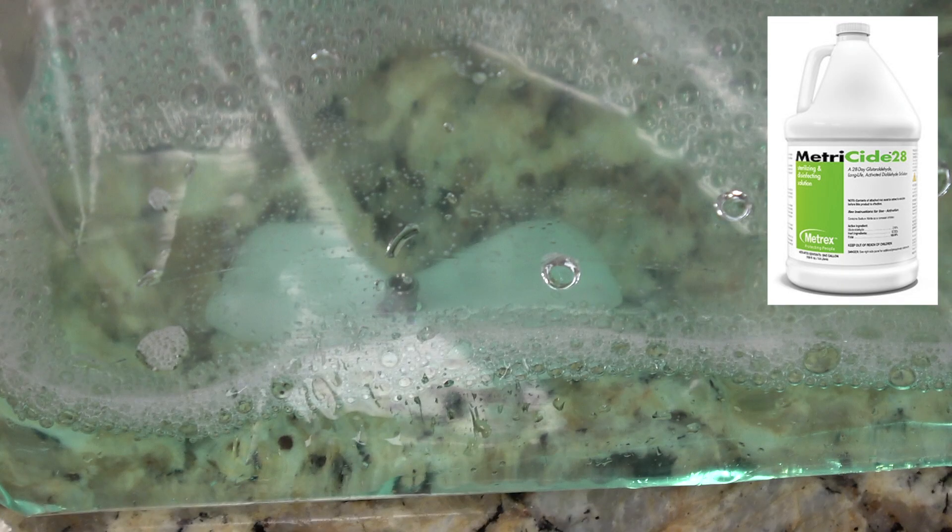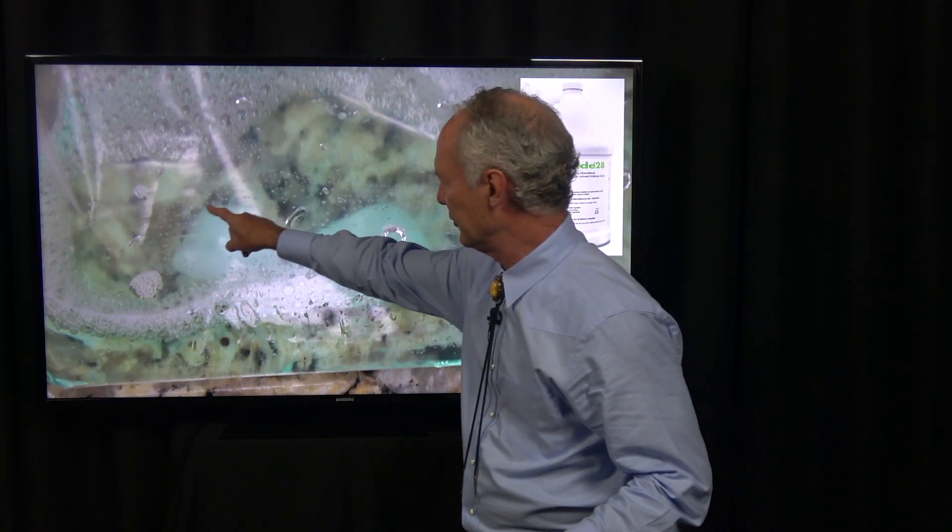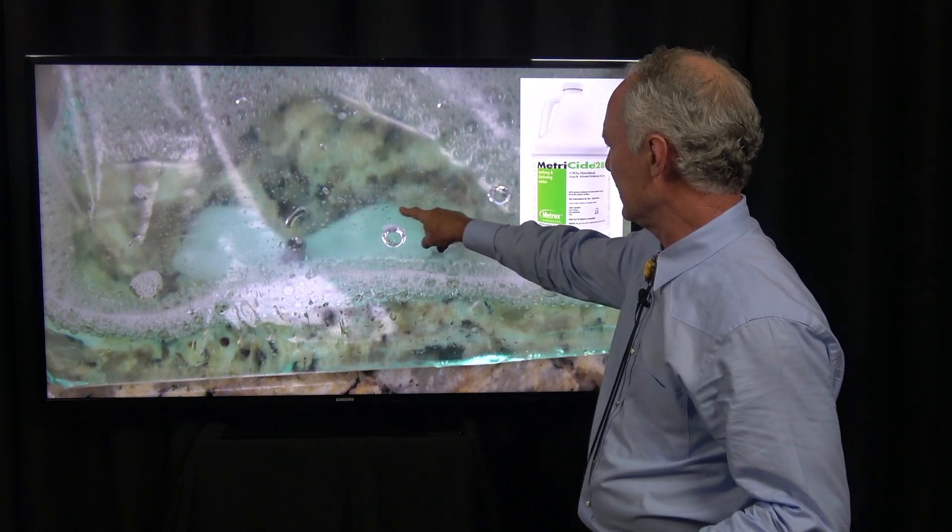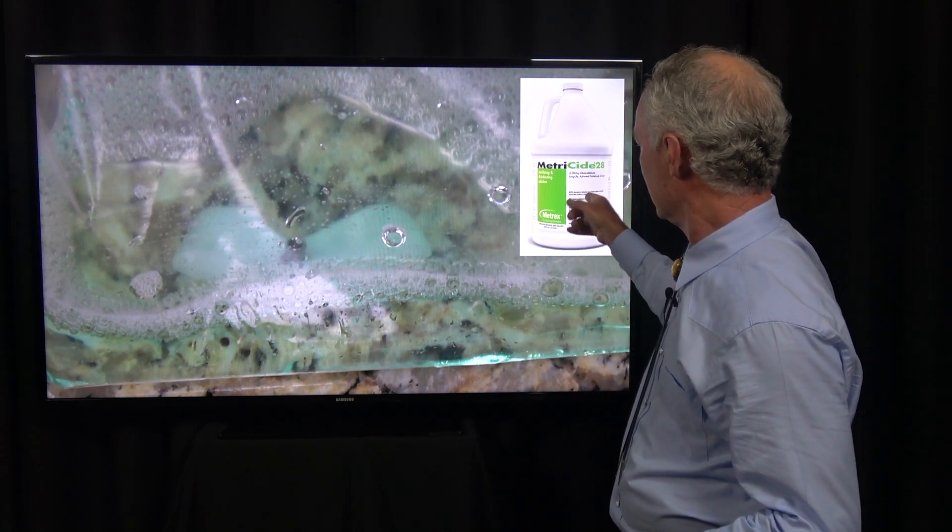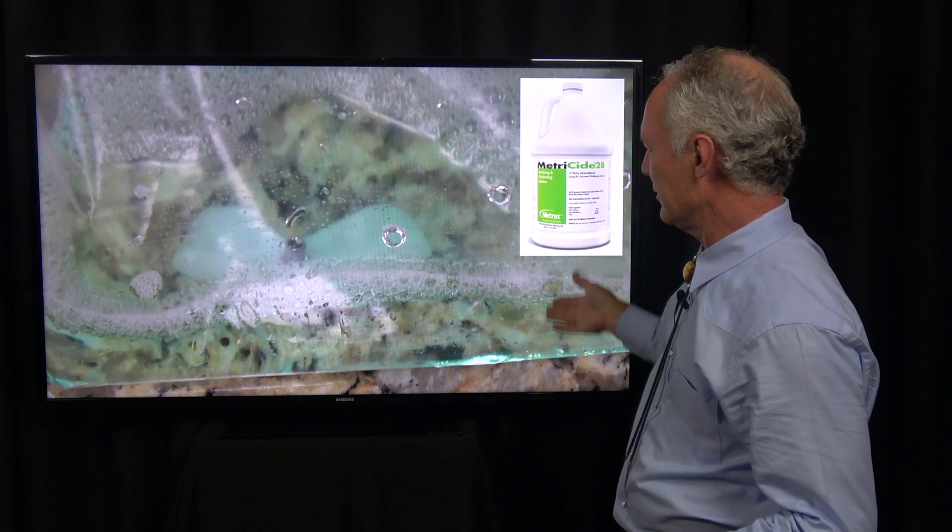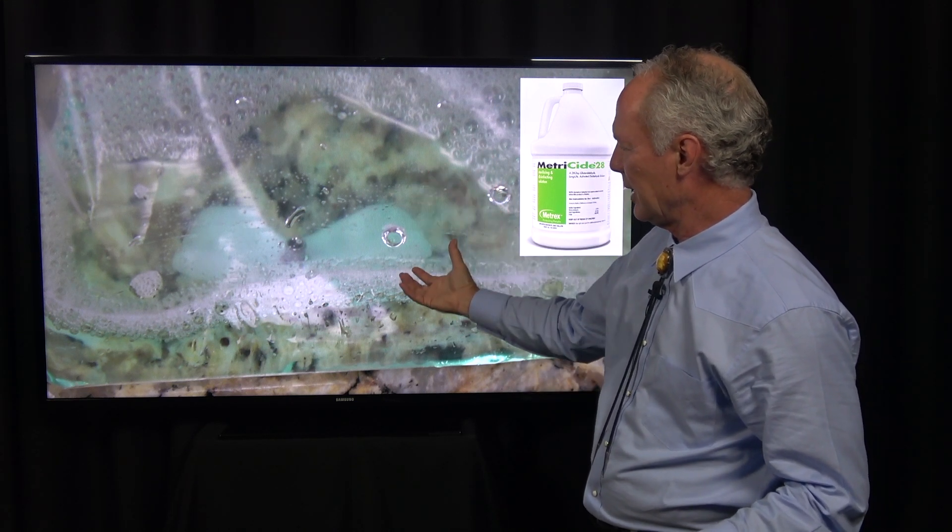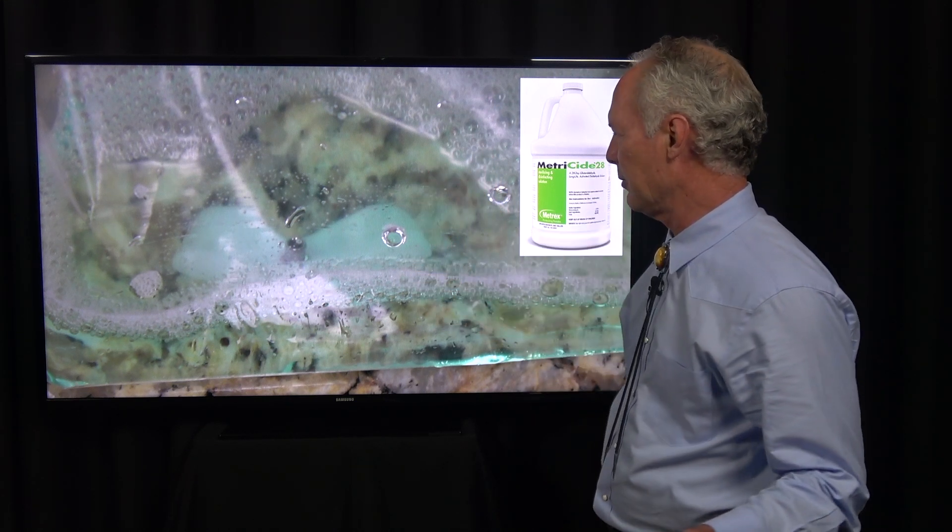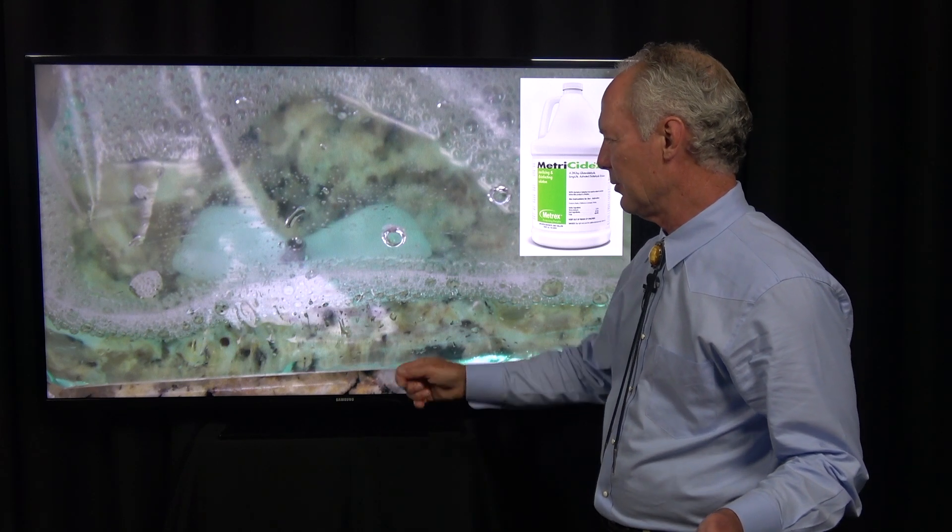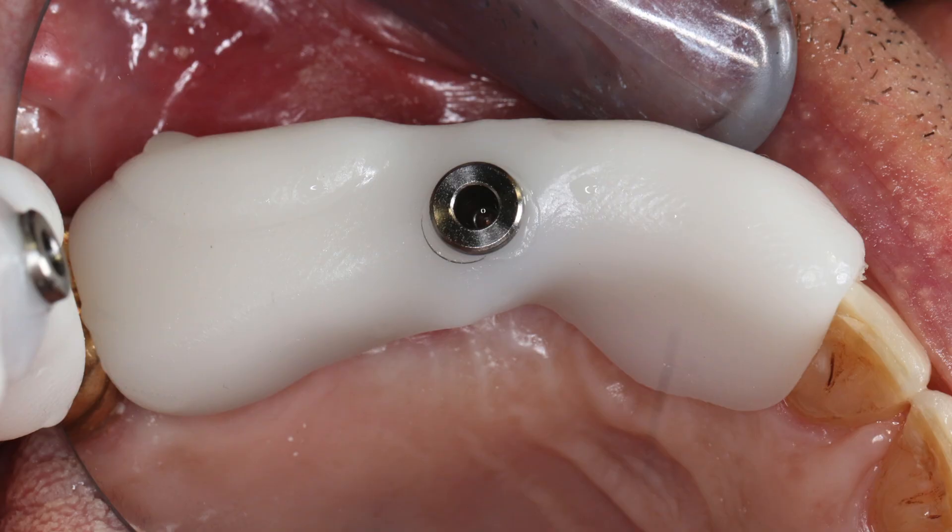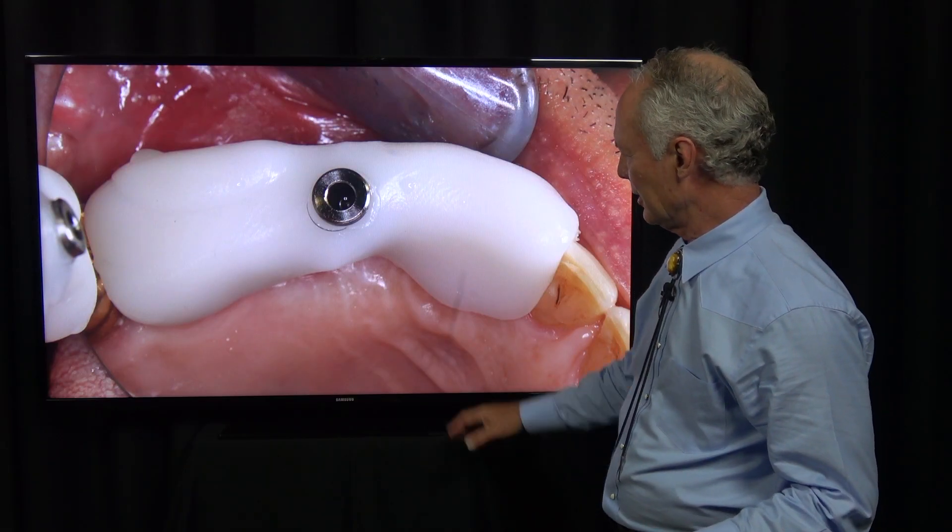Then you're going to disinfect the stent with whatever you use. We put it in a plastic bag for the appropriate time, then rinse it well. Put it in a cup of water and rinse the sterilizing solution off.